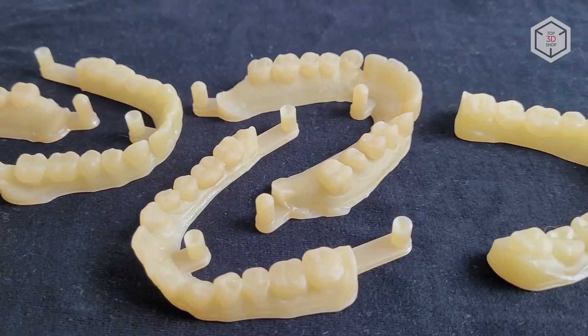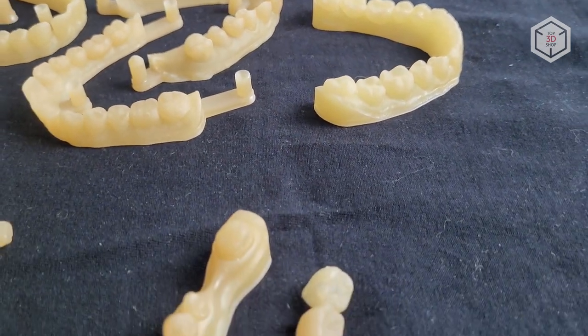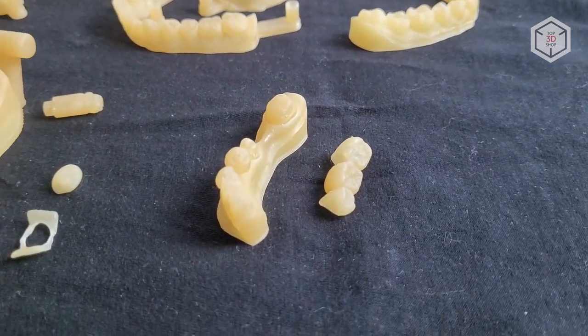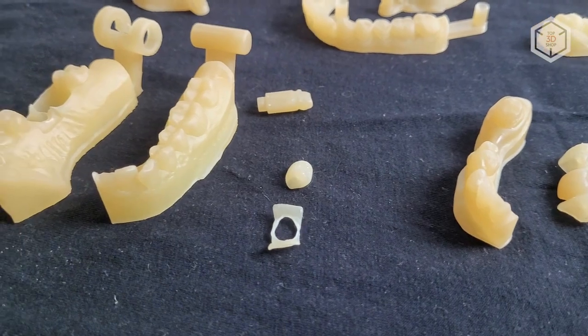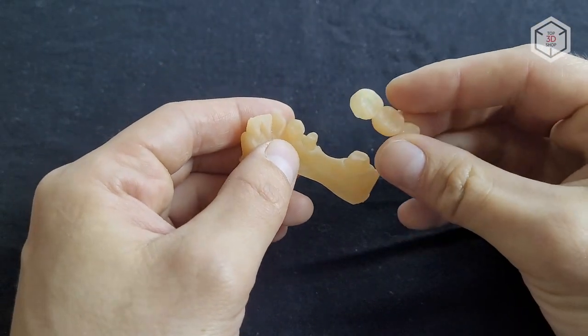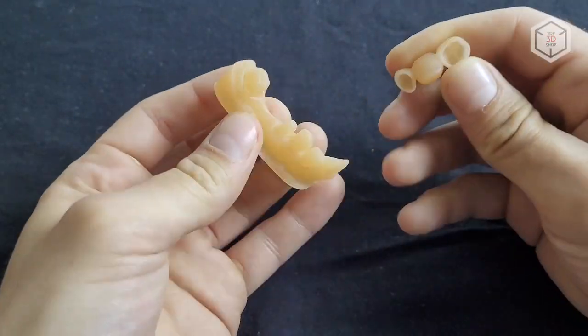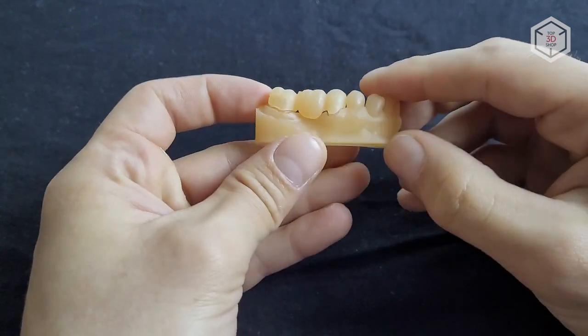The surface quality turned out to be more than satisfactory on all of the parts. Some small traces from the supports were still there, but these seem inevitable. Additional post-processing is required to achieve an ideal part. The most important aspect of this test was to check whether the models with joints would fit each other well. The bridge and the first model were joined fine, with a little effort, but firmly.